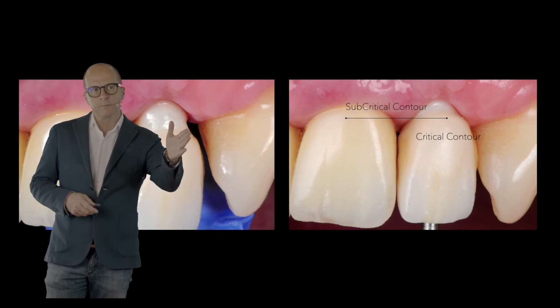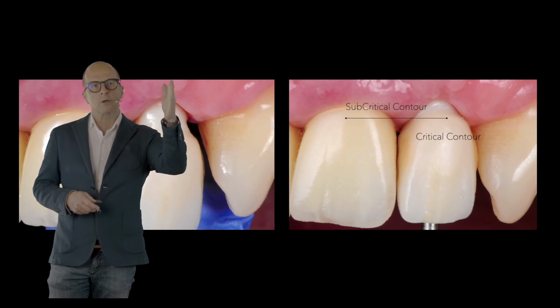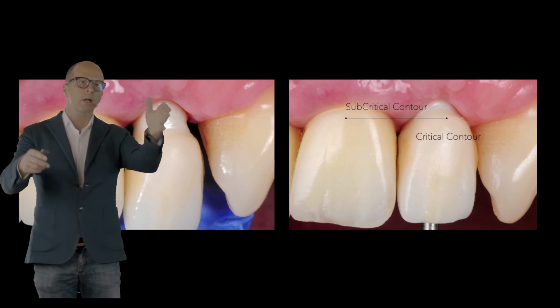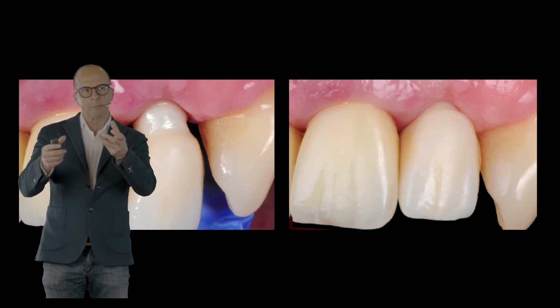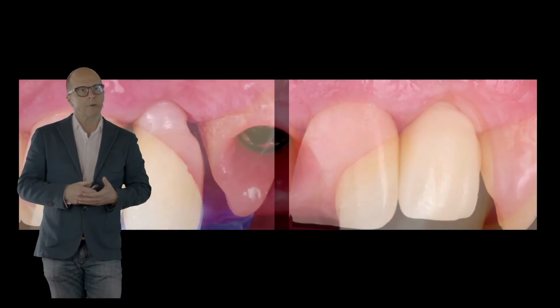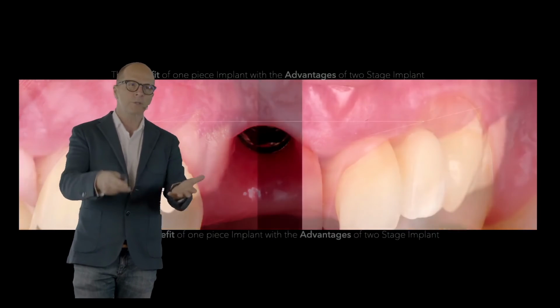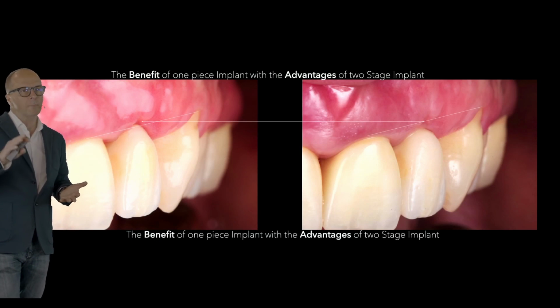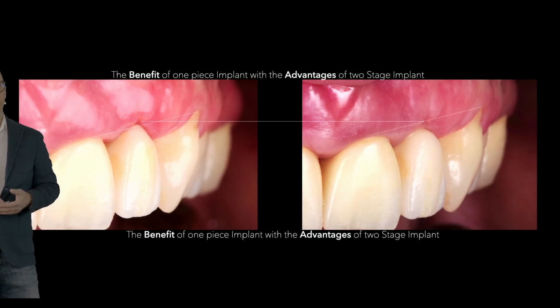As you can see, we can play at two different levels: the subcritical contour, which is made of zirconia, and the critical contour, which is made of ceramic. We can remove and replace the crown as many times as we want without harming the quality of the peri-implant soft tissue. This is what we can achieve with ease and predictability. This is the final outcome with the benefit of a one-piece implant and the advantages of a two-stage implant.